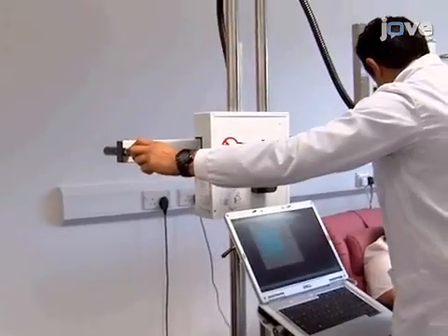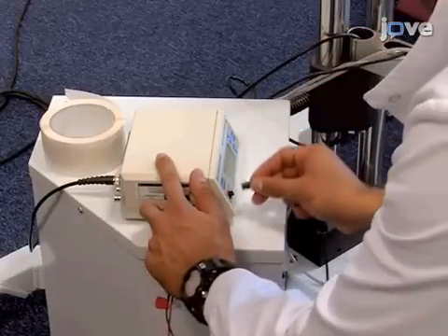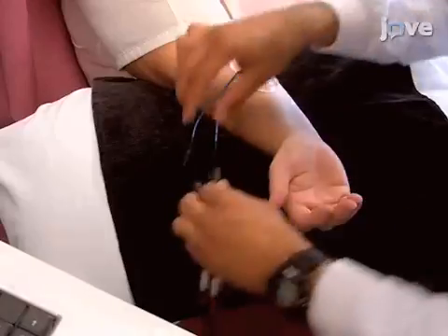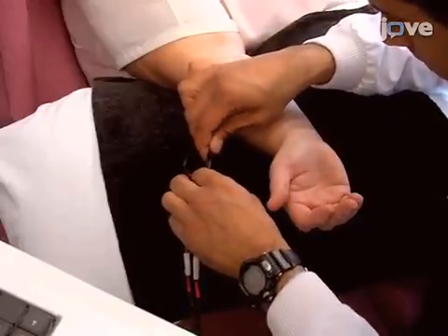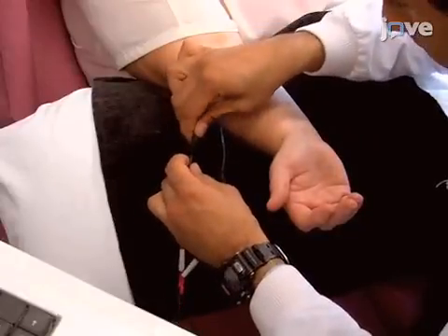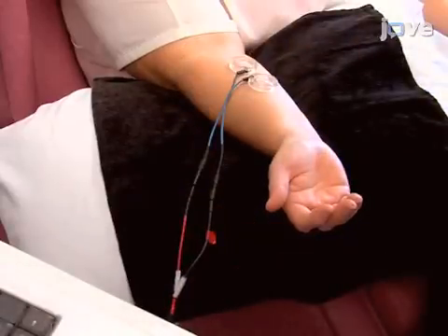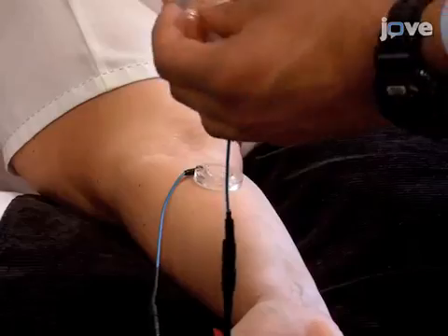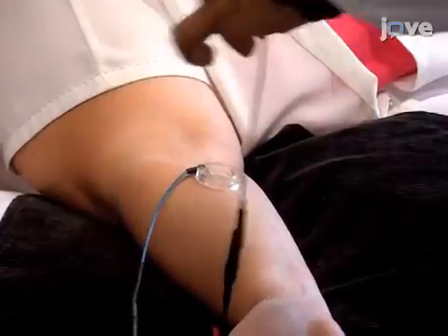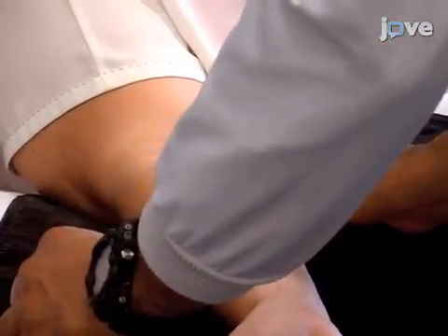Next, prepare the perspex chambers. First, attach their plugs to the iontophoresis controller. Then attach the chamber containing acetylcholine to the anodal connection and attach the chamber containing sodium nitroprusside to the cathodal connection. Then connect the two chambers to the volar aspect of the secured forearm using double-sided adhesive pads.